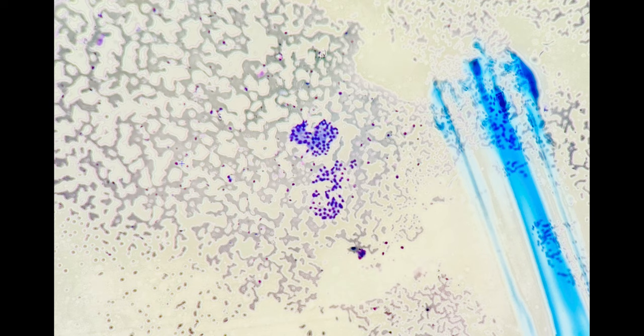So the adequacy criteria for a thyroid specimen is you need six or more groups of 10 or more follicular cells. So this is just one representative area, but we had more than six groups of 10 or more follicular cells. So we deemed it adequate. And follicular cells, the size are generally the size of a red blood cell. So you can use that as a yardstick.